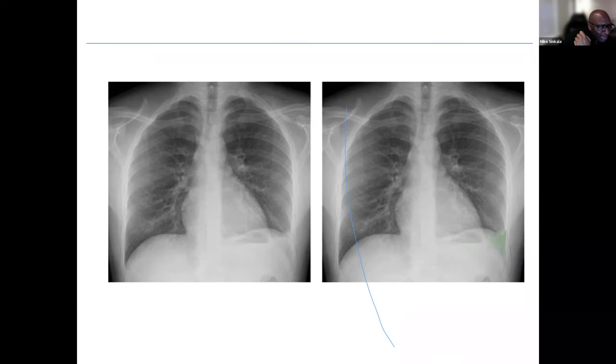Are there any pathological chest X-ray features in epileptic patients? Not really. I think epilepsy is more neurogenic. But if somebody has accidentally swallowed saliva, you might see features of aspiration pneumonia, possibly in the lower aspect of the right lung. So it would be aspiration pneumonia, but otherwise it's not pathognomonic for epileptic patients at all.